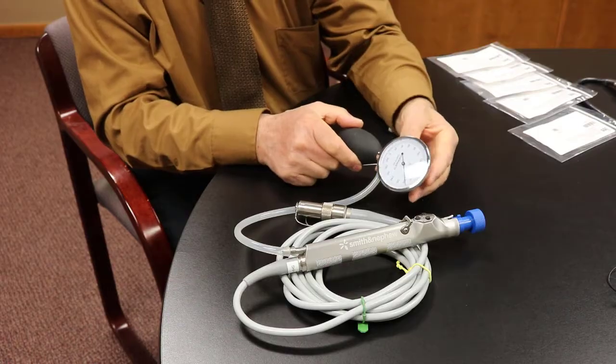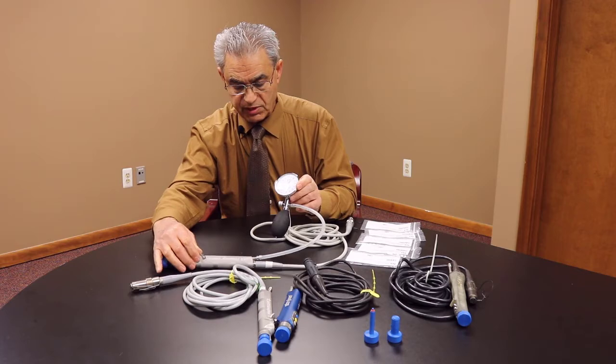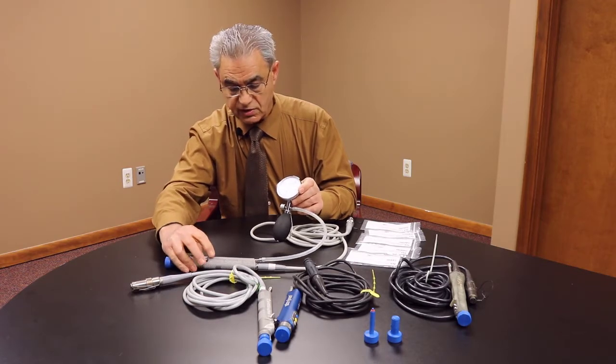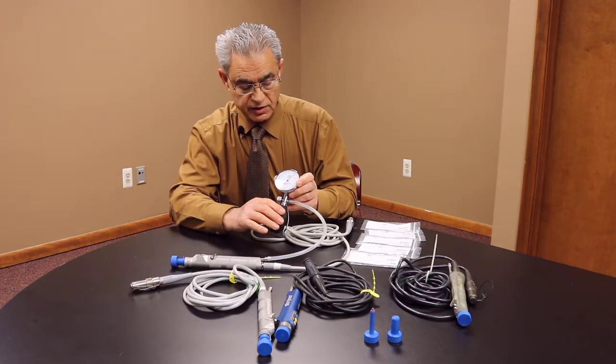If there's an issue with it, you see the gauge coming down. You can also manipulate the switch just in case. This shaver is good.